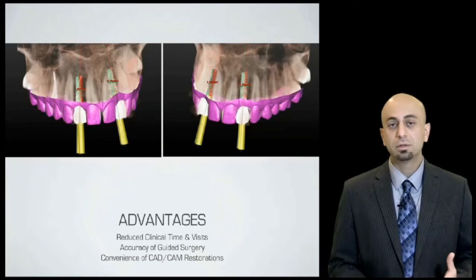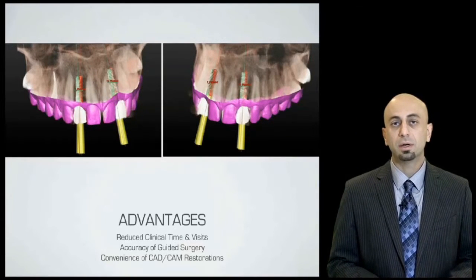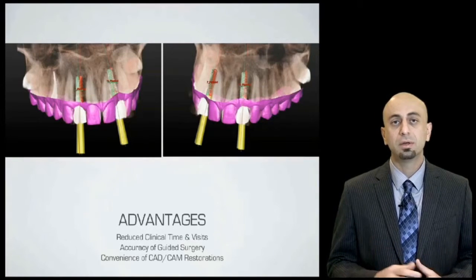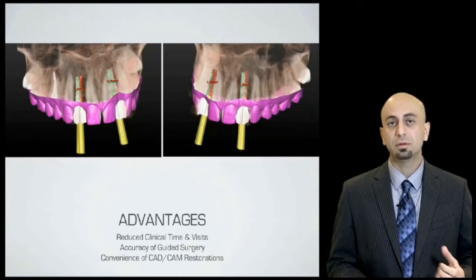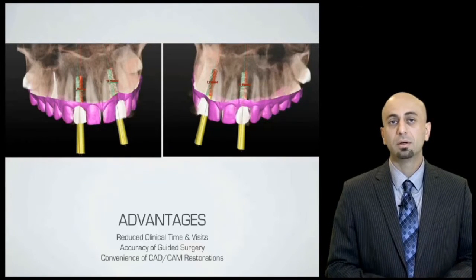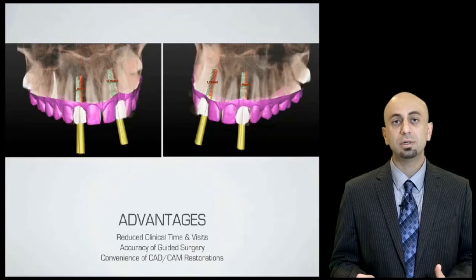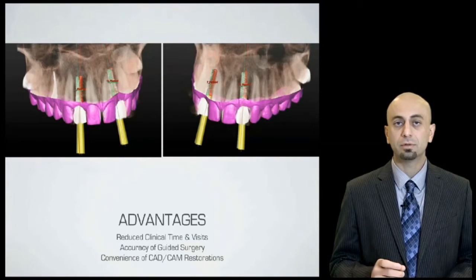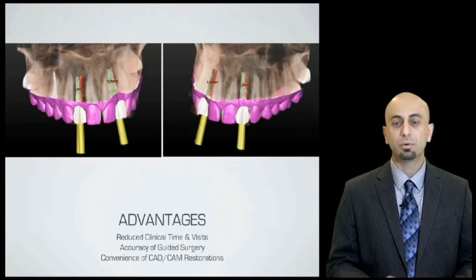And another advantage among many is the advantages of having CAD/CAM restorations. Essentially, using the data that we collect from the patient, we can send a file to a CAD/CAM milling machine and have that machine mill out the final restoration before the appointment.